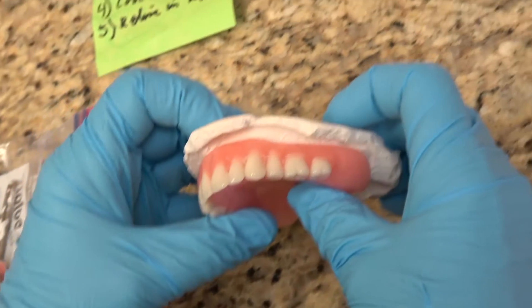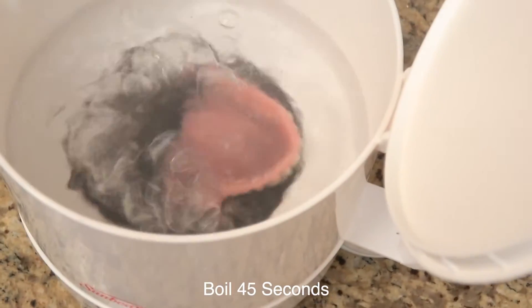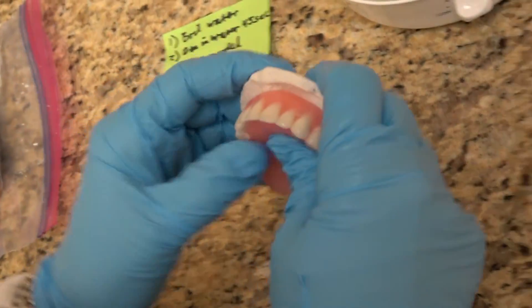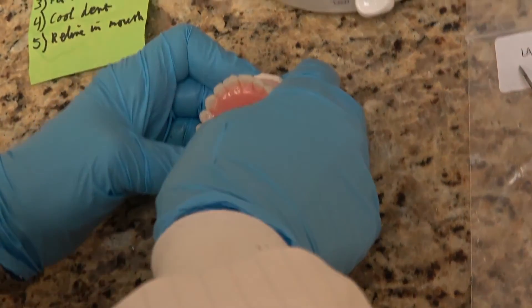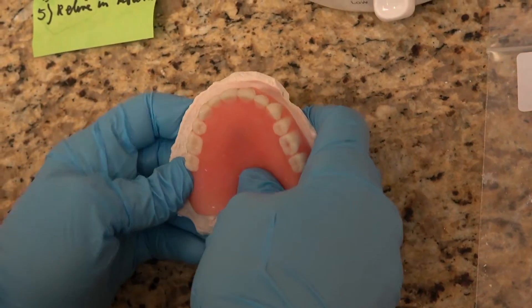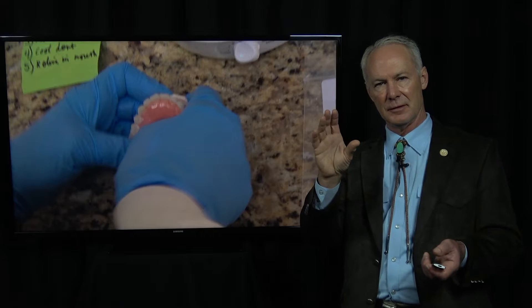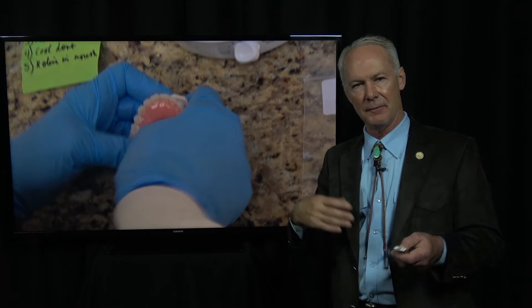This is a stone model of the arch after the teeth have been extracted. Boil it for 45 seconds, put it back on that stone model, and mold it. We had these in the office, and I've always had my lab fabricate an immediate denture from a preoperative study model that oftentimes has the teeth on the model, so they're kind of guesstimating how the laboratory denture is going to fit.